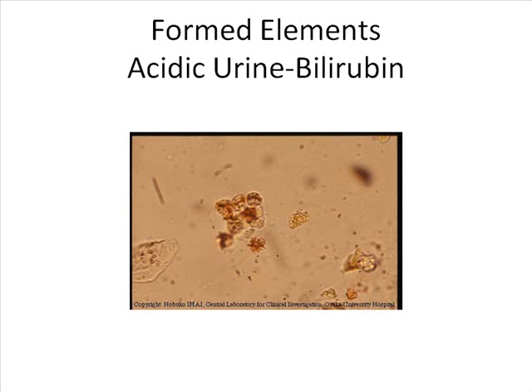See these little cross things? And they are very unusual to see. I have to tell you, I've never seen them. I expect if we took one of those urines that had high amounts of bilirubin and maybe kept it in our refrigerator for a couple weeks, we might see them form.